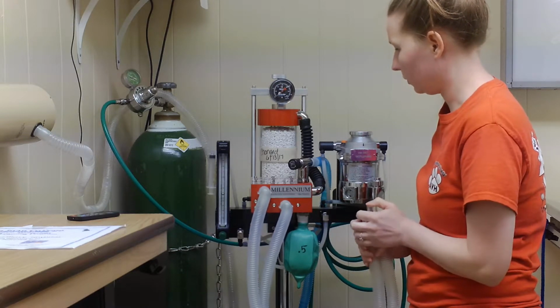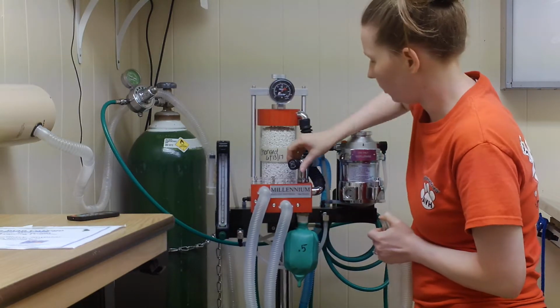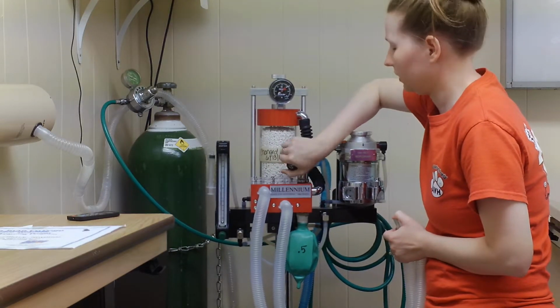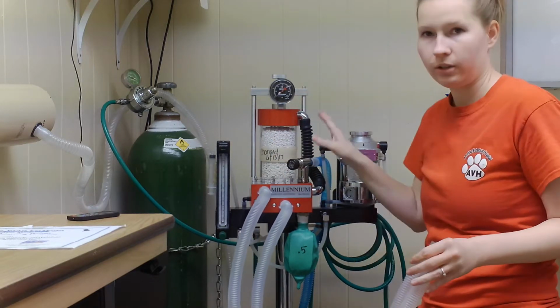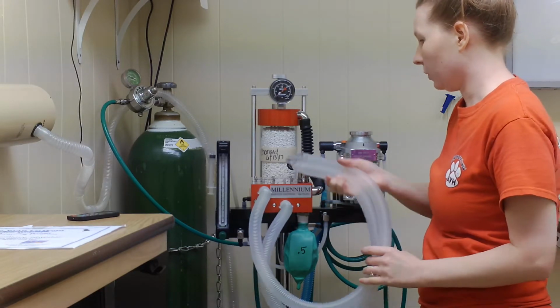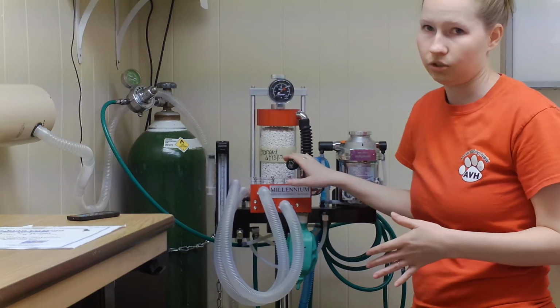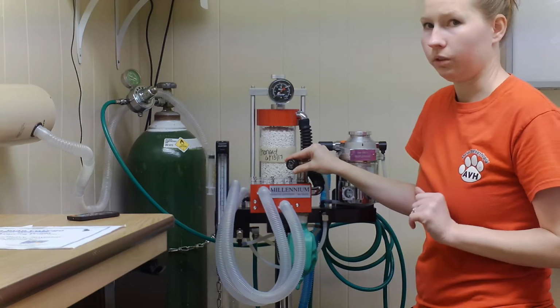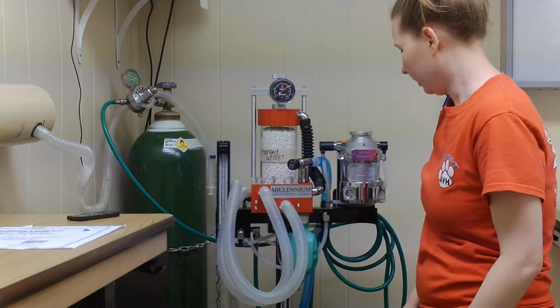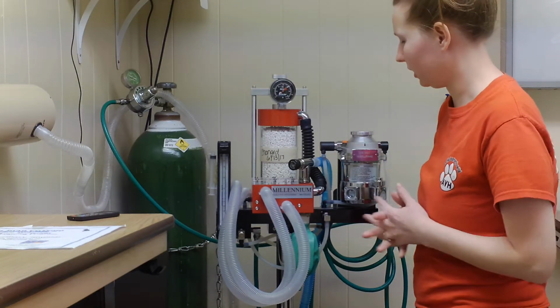I would say that this is a properly working anesthesia machine. So I'm going to go ahead and turn off my oxygen and open up my pop-off valve. Leaving it closed is one of the most dangerous things to do. I'm going to make sure that it's completely open. Always make sure that your pop-off valve is open, so that your patient doesn't wind up getting any kind of lung damage, because if it's closed, the patient's not getting any oxygen, and that's when you wind up with a whole world of hurt. So always make sure that it's open. In our office, we're technically not allowed to touch the pop-off valve. Only the doctors are allowed to touch the pop-off valve.